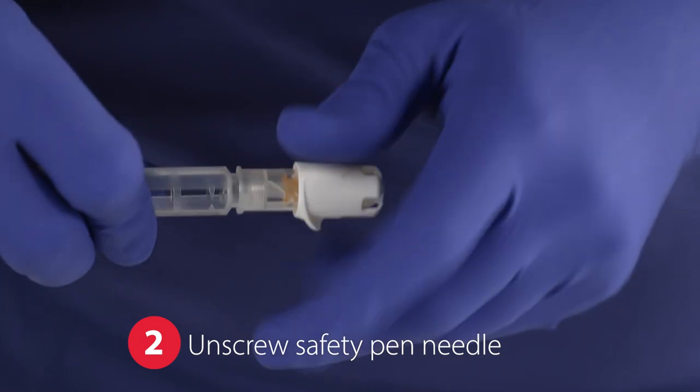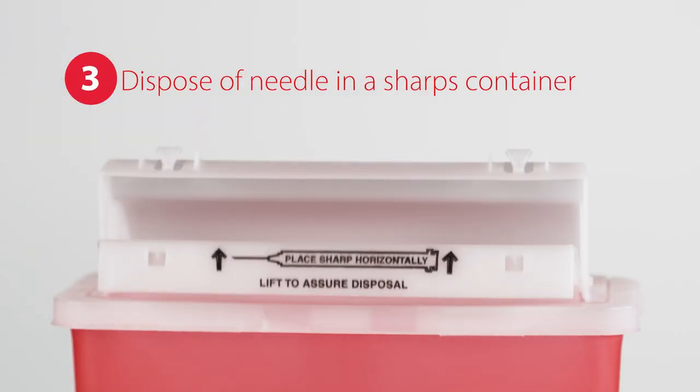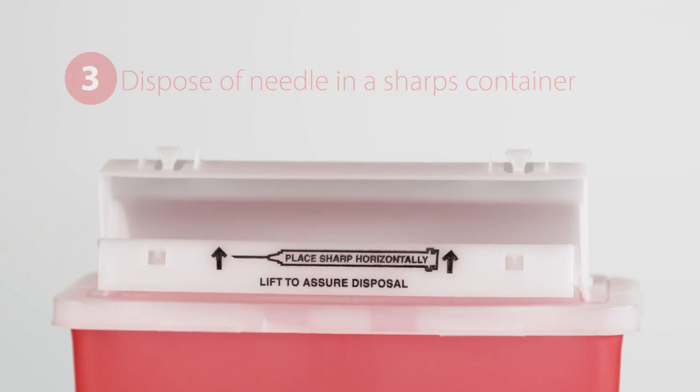Unscrew the needle from the pen injector. Immediately after the injection, dispose of the needle in a sharps container, following local safety and disposal regulations.